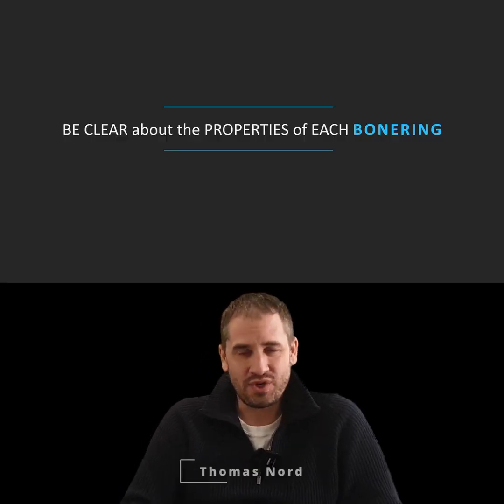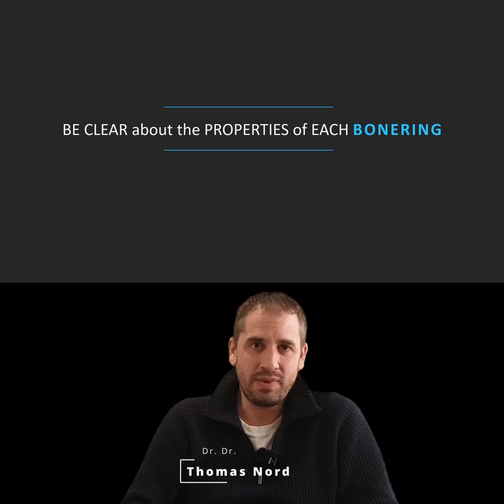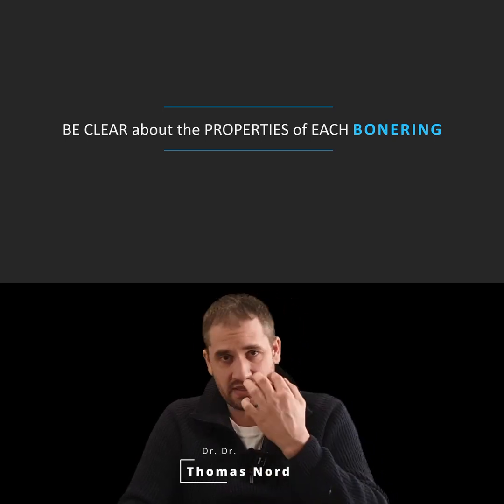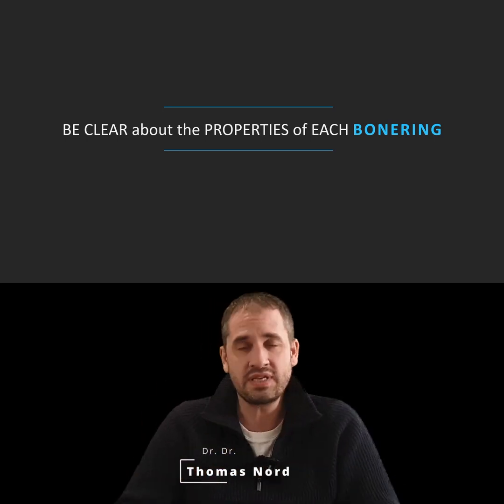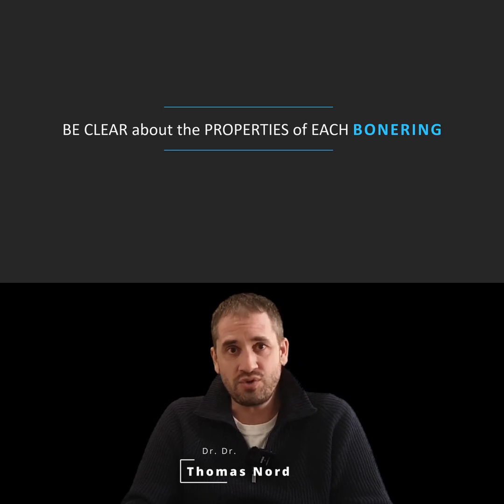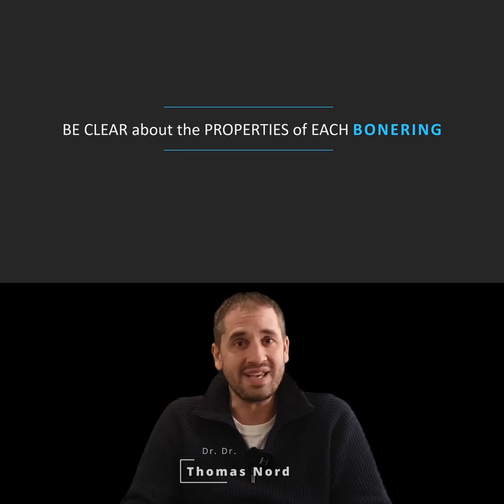Hi, it's Thomas Nord. I want to tell you something about the properties of some bone rings you can harvest inside the mouth or outside of the mouth, or about allograft bone rings, because I want you to become a bone ring master.